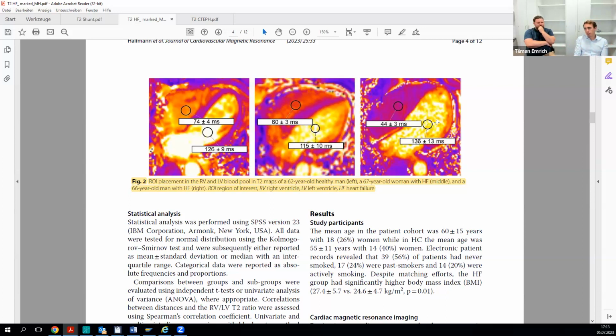The only thing that you have to be careful about is to avoid flow artifacts. And we did evaluate whether it was necessary to put more regions of interest in there or evaluate the short axis as well. But really there was quite concordant results. So we decided to use the 4-chamber view just for the ease of use, because you can teach anyone to do that, and visually it's the easiest to gather, I think.